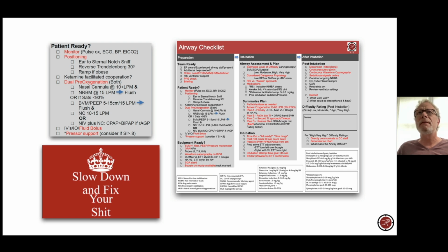And the purpose of that is to use that when the patient has high minute ventilation. So when the respiratory rate is high, and they've got big tidal volumes, they might be breathing at 30 liters per minute. You're only providing them with 15 liters per minute with your mask, and they're going to entrain additional flow and dilute that FiO2. So two sources of oxygen, right?